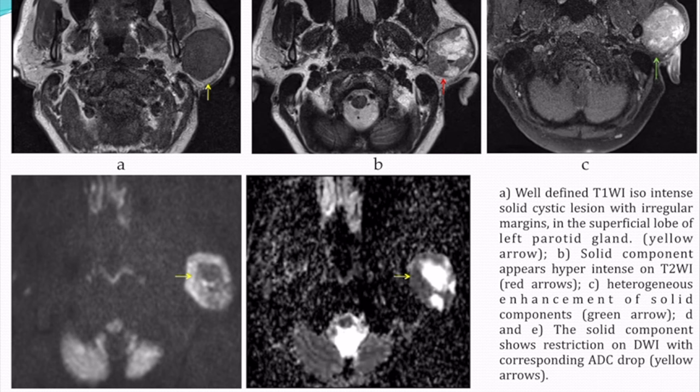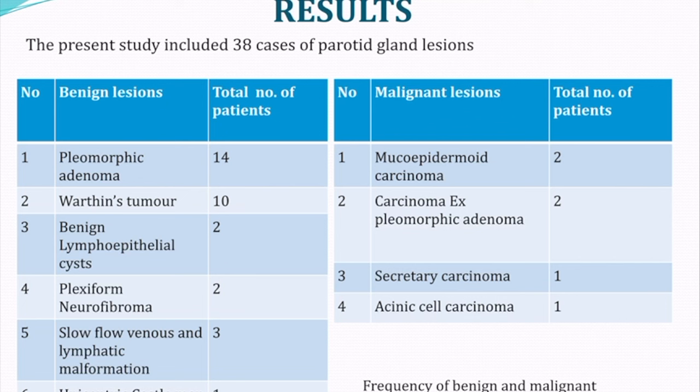A well-defined T1 iso-intense solid-cystic lesion with irregular margins in the superficial lobe of the left parotid gland showed a solid component hypo-intense on T2-weighted images with heterogeneous post-contrast enhancement and no true diffusion restriction. The diagnosis given was acinic cell carcinoma, which was confirmed on histopathological examination.